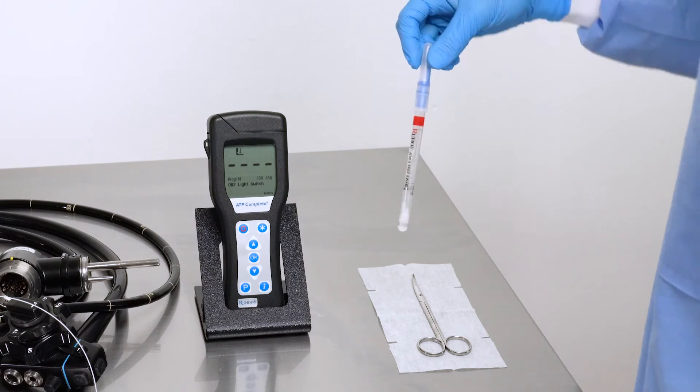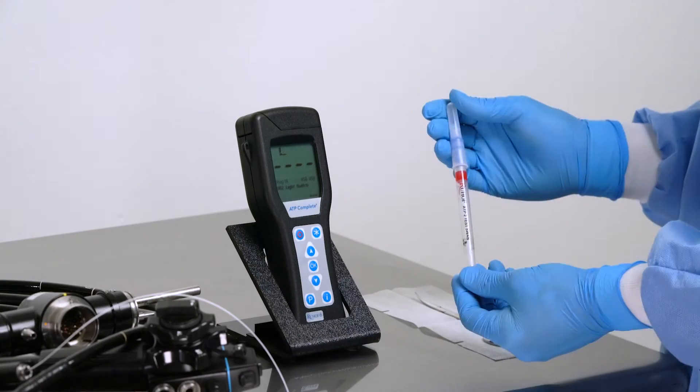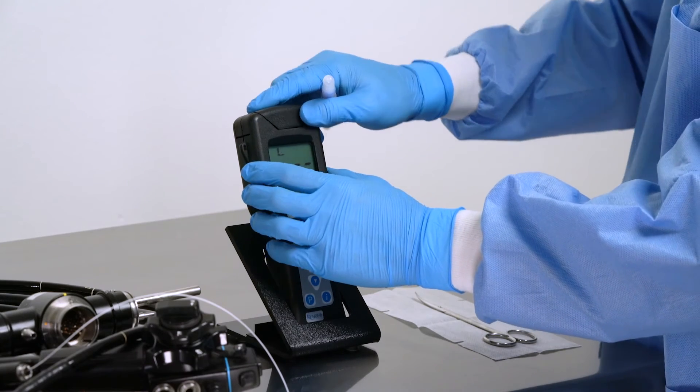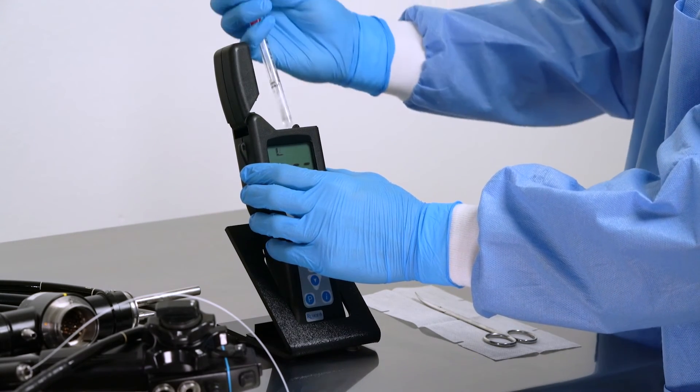Insert the test swab tube into the Ruhoff ATP Complete handheld device, close the lid and press the OK button.